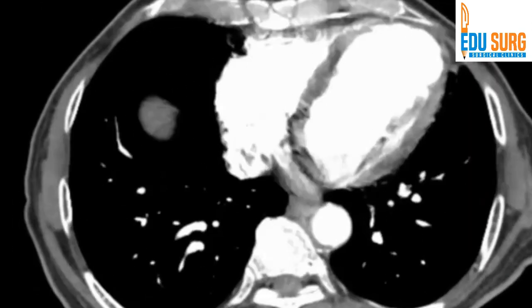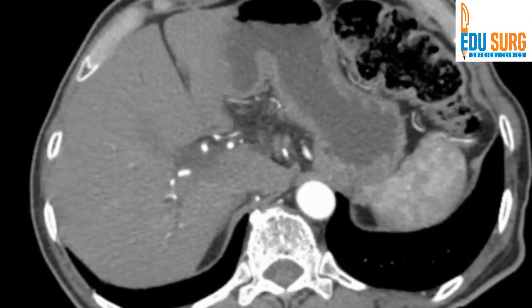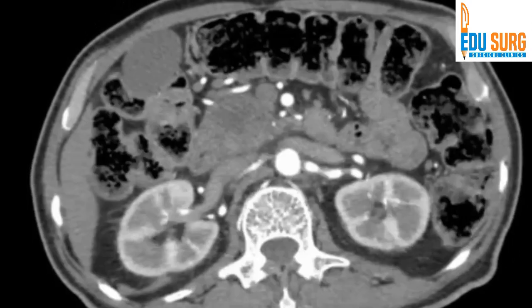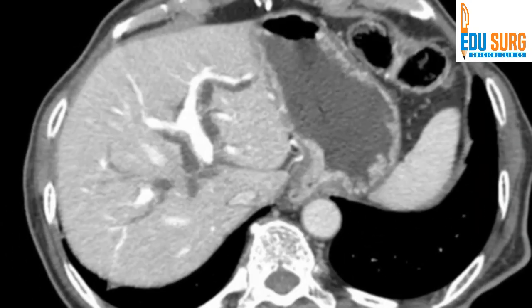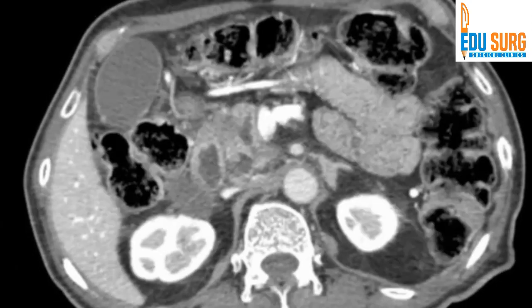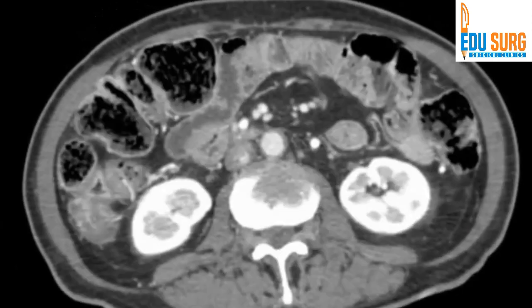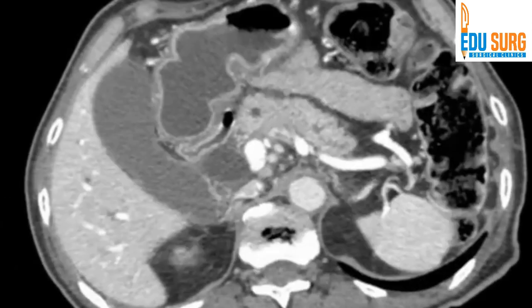This is the third case we are going to see today. We are looking at the phases of the third case. Just to revise, you can look at the lower lung cuts, the liver, ascites, peritoneal deposits, where the mass is, are there varices, nodes, liver lesions — commonly seen points — vascular variations, and the relations of the vessels with the tumor. If you note down these points, it will be very easy when we discuss the case together.